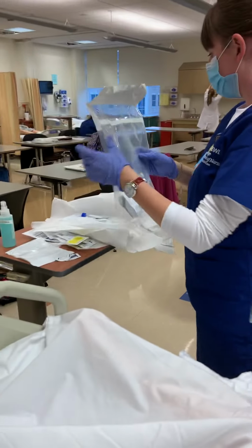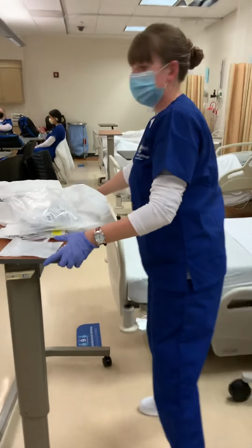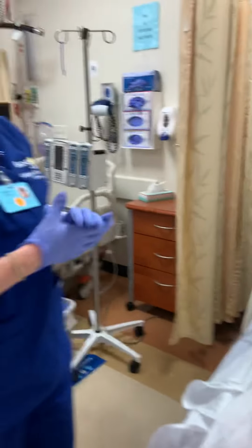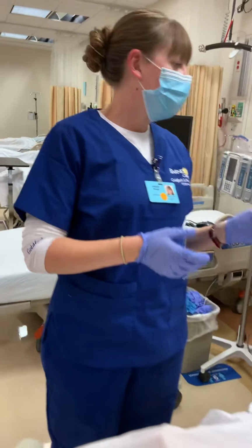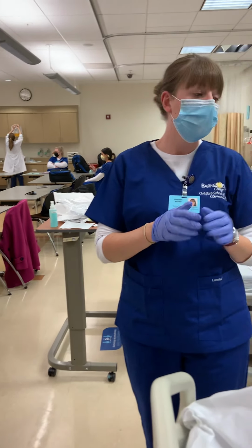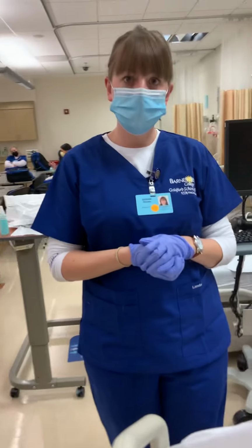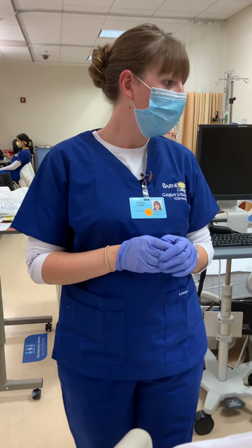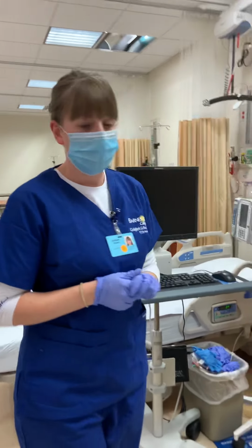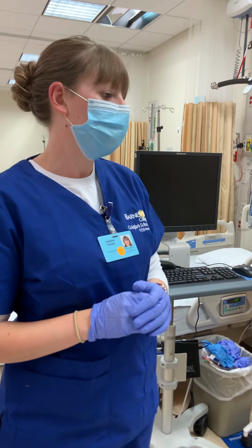Remove all of my supplies here. I'm just going to move this since I'm coming right back to remove the catheter. If I weren't coming right back, I would leave the room, perform hand hygiene again, and document that I inserted the catheter and that I took the urine sample and then I sent that off to the lab. Make sure all of that would be in the system. However, right now I'm going to also show you how to remove the catheter.